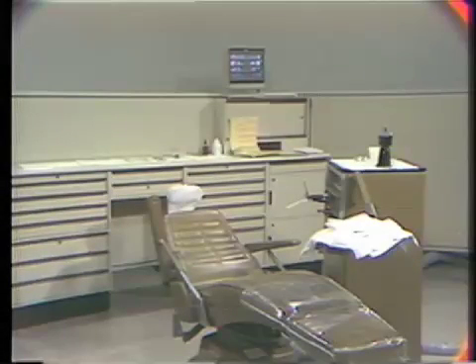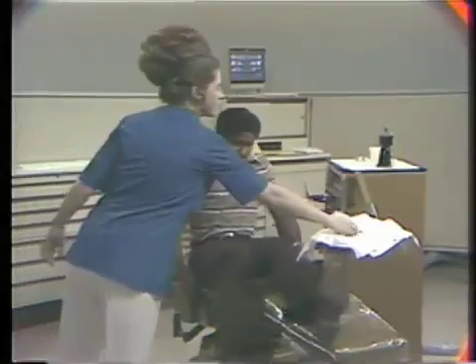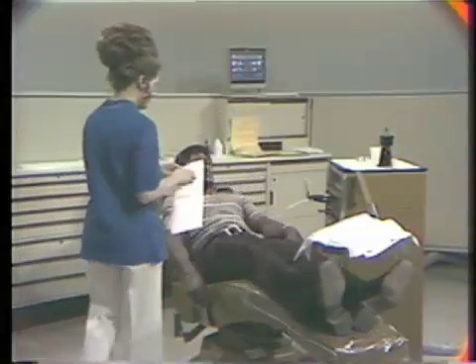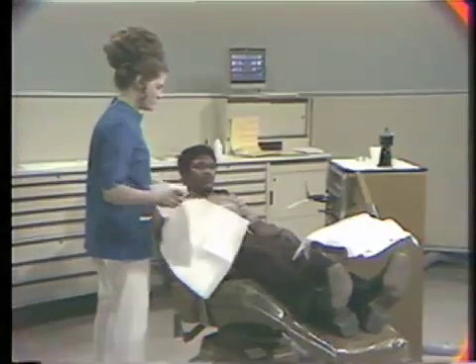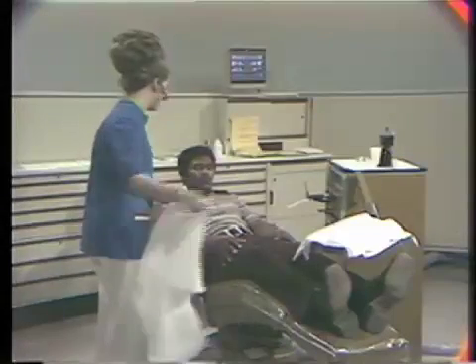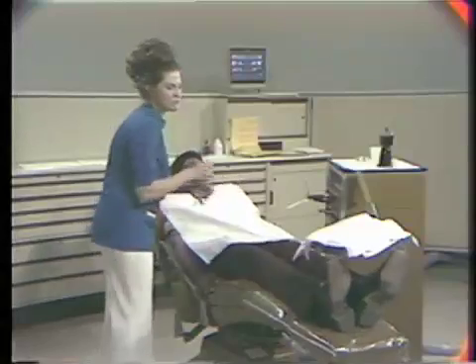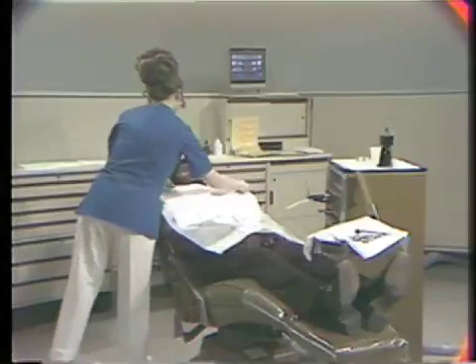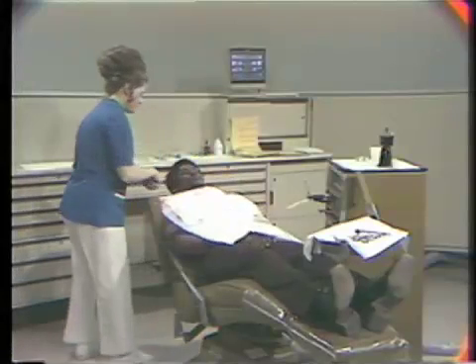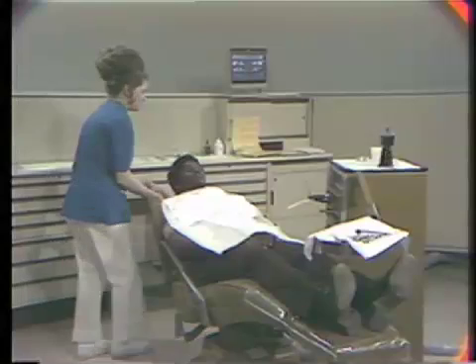Mrs. Betty French will seat the patient, Mr. Harry Winston, Jr. The chair has already been placed in a reclining position, and this is the position from which I'll be operating. And she places a large drape to cover the patient and protect them reasonably well from any splattering, and also to keep as clean an area for ourselves during the operating procedure. And she also places a cloth sterile towel immediately under his chin.